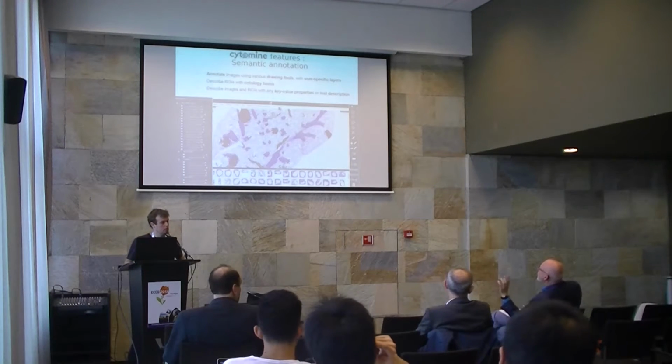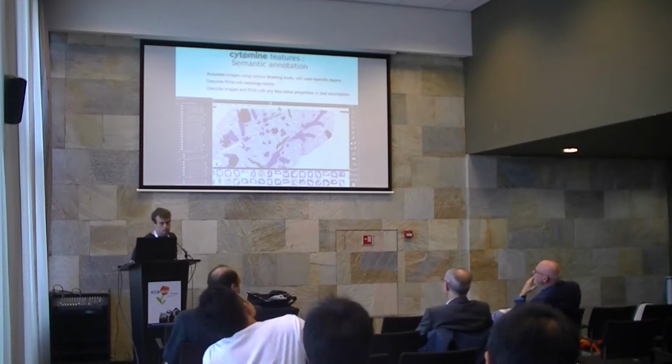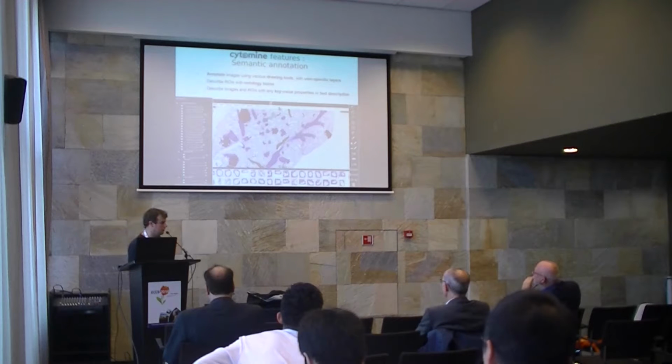Can you have a hierarchy of ontologies? You say this one also always has to contain this and this. So the only hierarchy that we have is relationship of parent and child. So here you have the tumor type and you have subtypes of tumors. It's the only relation that we have defined up to now.